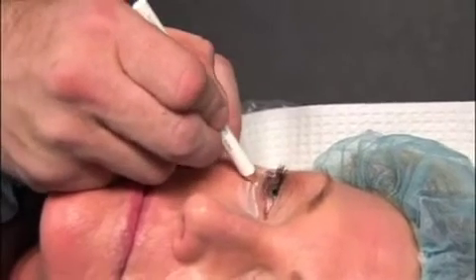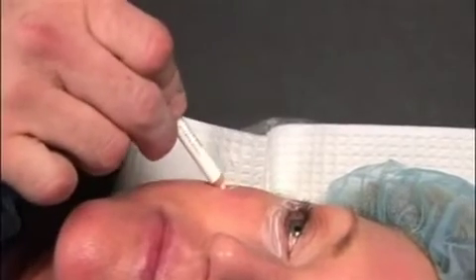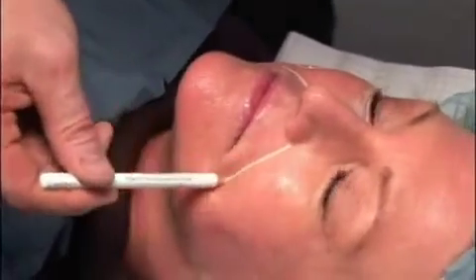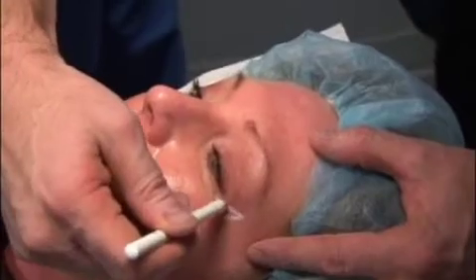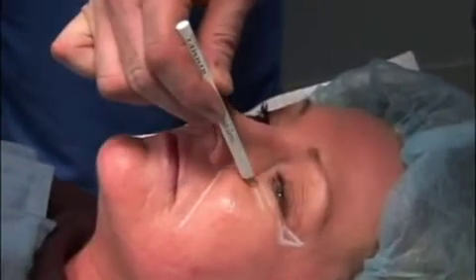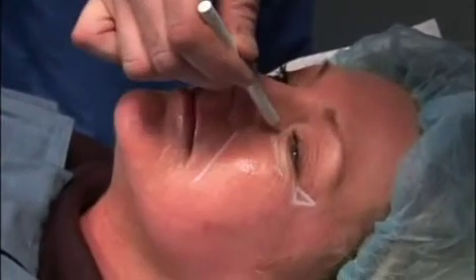Patient marking begins when the surgeon evaluates the patient's area of concern for facial grafting, the face or anywhere in the body. In this patient, fat grafting to the mid-face and other areas of the face will be performed. Marks are performed using either a white pencil or a purple surgical marking pen.